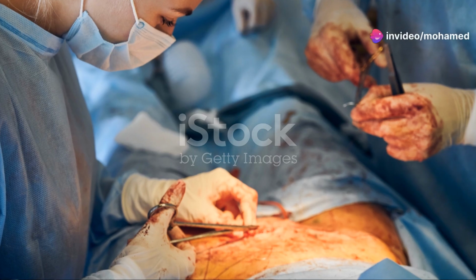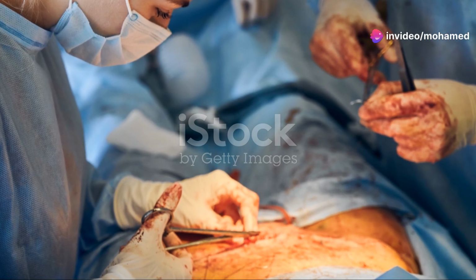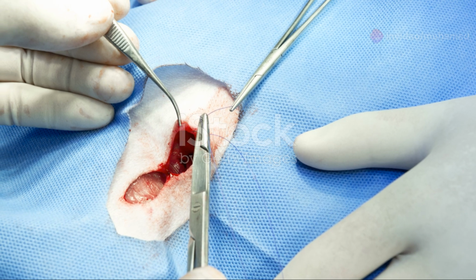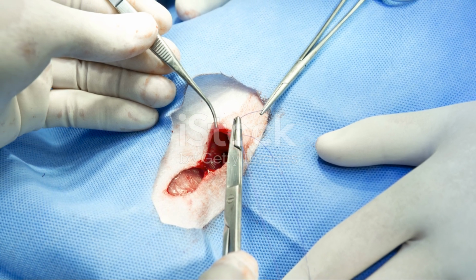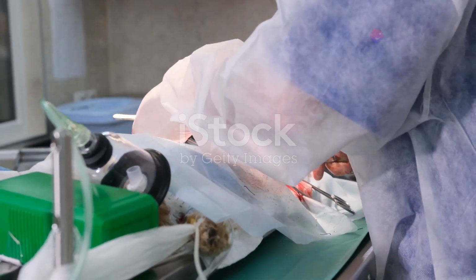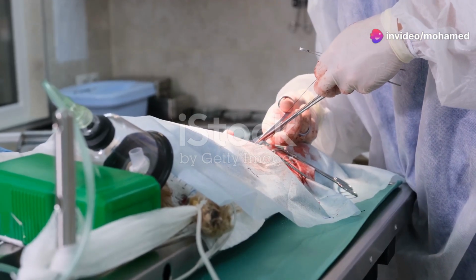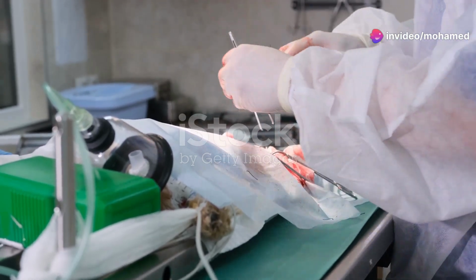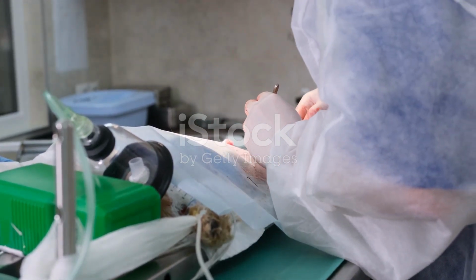On the flip side, multifilament sutures are braided or twisted, like silk or Vicryl. These sutures are easier to handle and tie, making them a popular choice in many surgical procedures. They offer better knot security and are easier to handle, but have a higher risk of infection due to their braided structure. The multiple strands can trap bacteria, so careful handling and proper technique are essential.